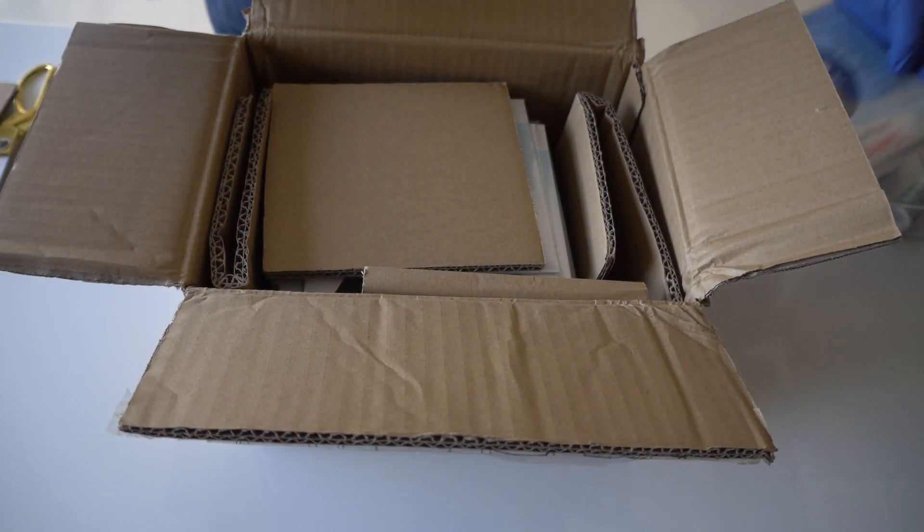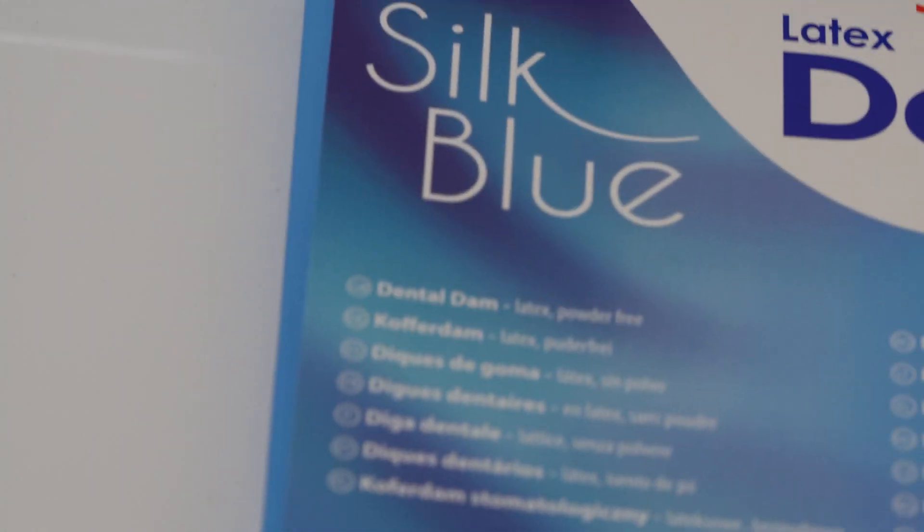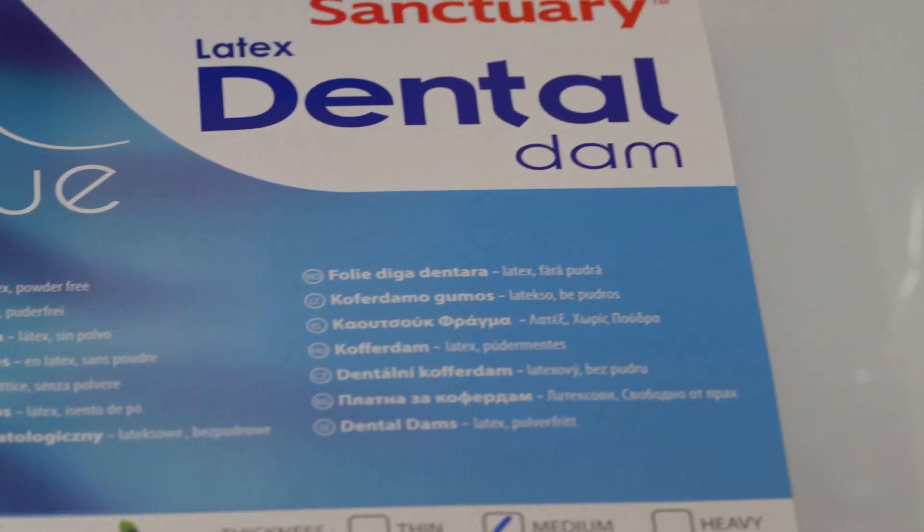The second most important part of any rubber dam set is the rubber dam sheets. About a year back I made a video on my favourite rubber dam sheet. Since then I've had an opportunity to use several other brands. I should also thank Sanctuary — they saw my video and sent me a bunch of rubber dam sheets to evaluate. I now have a new favourite. I had started using thick gauge sheets because I needed a lot of retraction for restorative work.